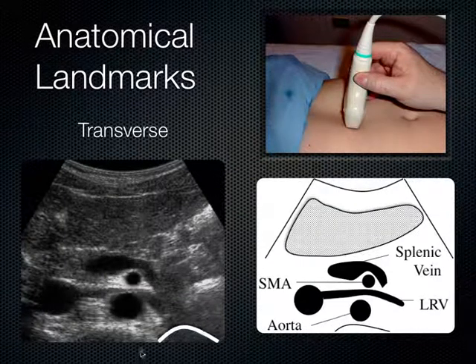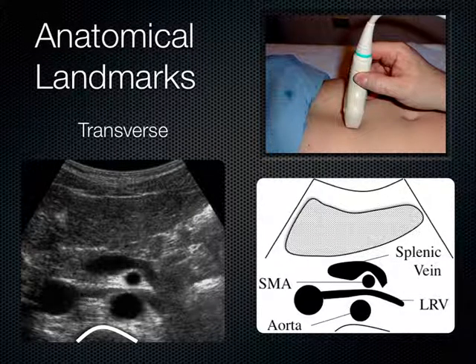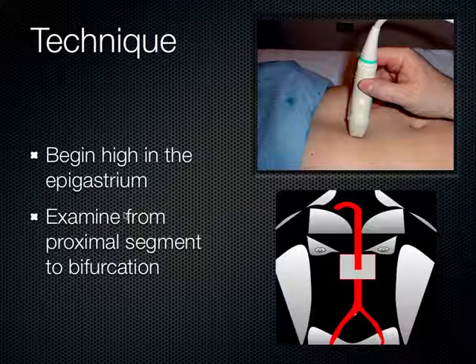One more time. Spine shadow. What's this? Aorta. What's this? IVC. What's this? SMA. Looks like a mantle clock. What gets nut cracked between the aorta and the SMA, draining into IVC? Left renal vein. What vessel crawls over the SMA? Splenic vein. This is all the pancreas and then the liver.